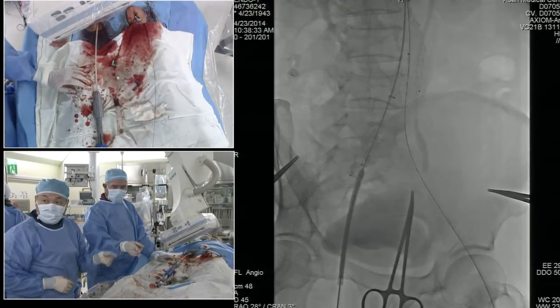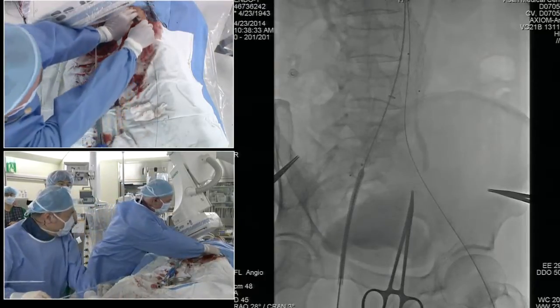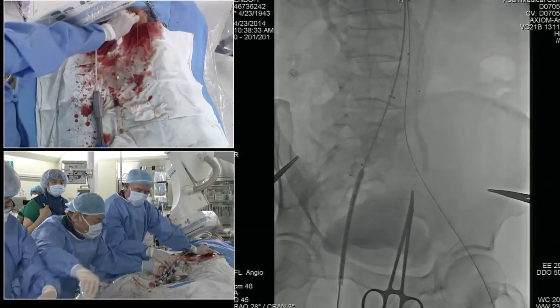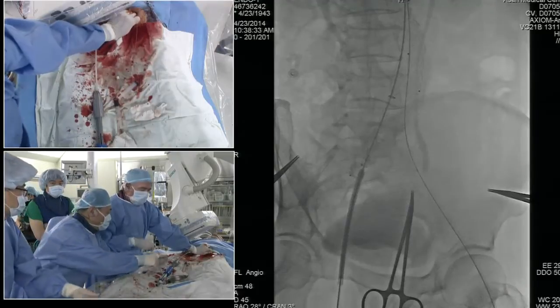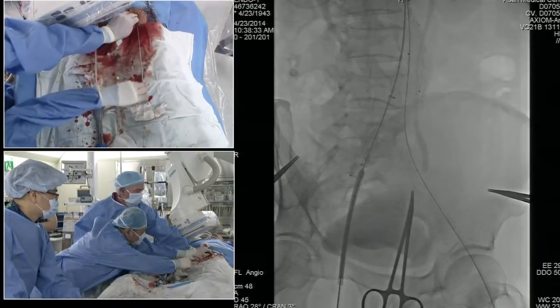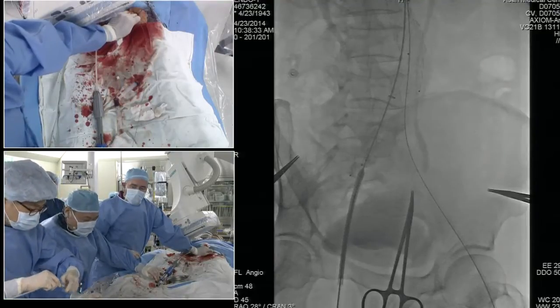And we'll need a dilator too. This is it. Can we use a dilator, one dilator? Yeah. Remember, you can always overlap in this gate, the contralateral gate. Okay. Okay, so we're just dilating up with this one dilator. Okay. Great. And then we'll go ahead and take the 16 by 93 contralateral limb.